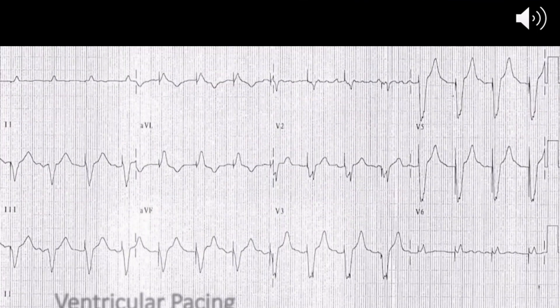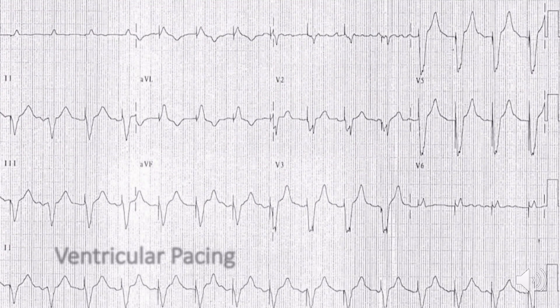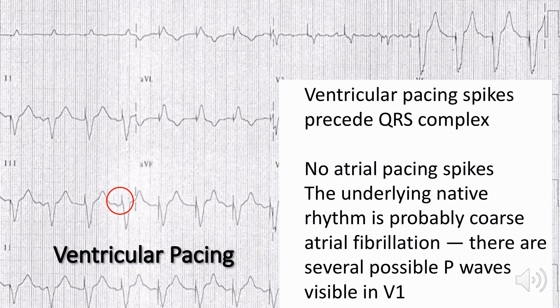The next example is a ventricular pacing ECG. As you can see in the red circle, there is a ventricular pacing spike that precedes the QRS complex, and there are no atrial pacing spikes preceding any P wave. In this particular case, the underlying native rhythm is likely atrial fibrillation, because you can see several possible P waves in V1, but otherwise the atrial activity is chaotic.